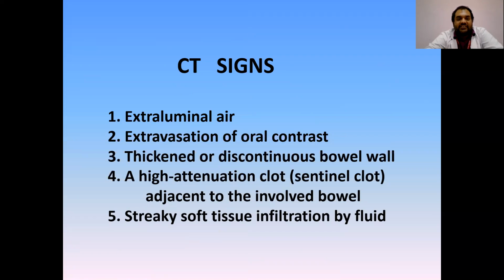CT signs of bowel trauma: extraluminal air, extravasation of oral contrast, thickened or discontinuous bowel wall, a high attenuation clot, that is the sentinel clot, adjacent to the involved bowel, and a streaky soft tissue infiltration by fluid.